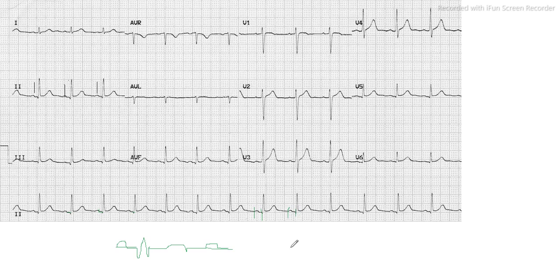Sometimes there may be AV conduction delay, sinus bradycardia or tachycardia, or different phenomena can be seen in which the PR interval may be increased. In that case it may not be normal sinus rhythm. So these things you need to keep in mind.